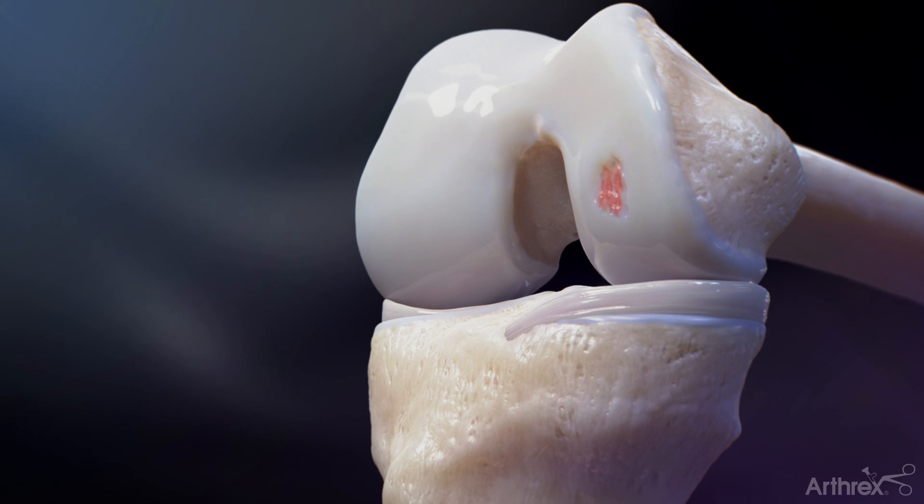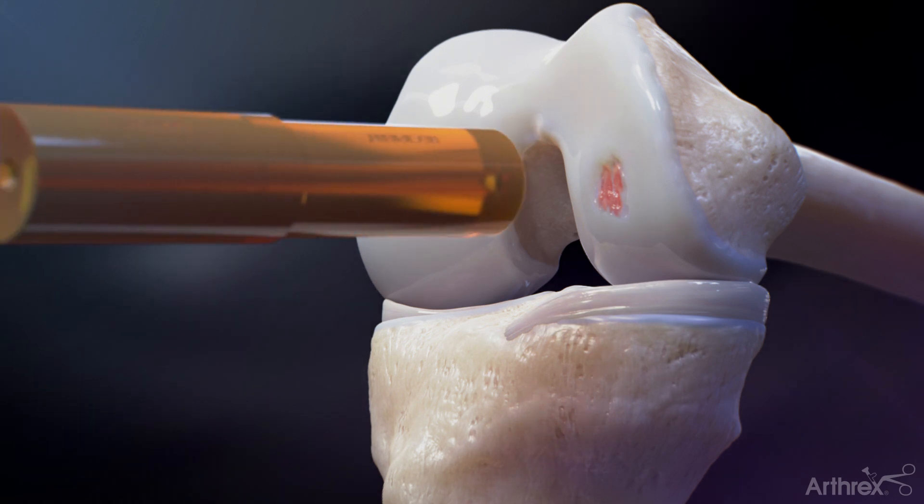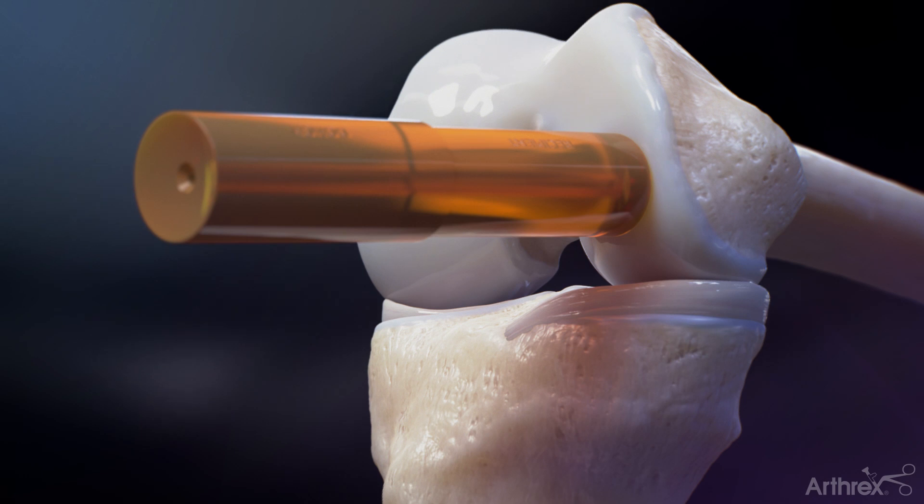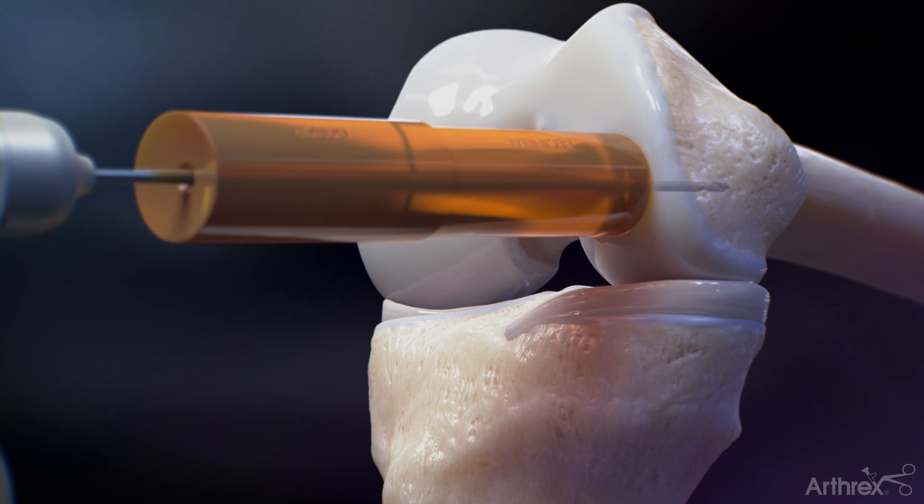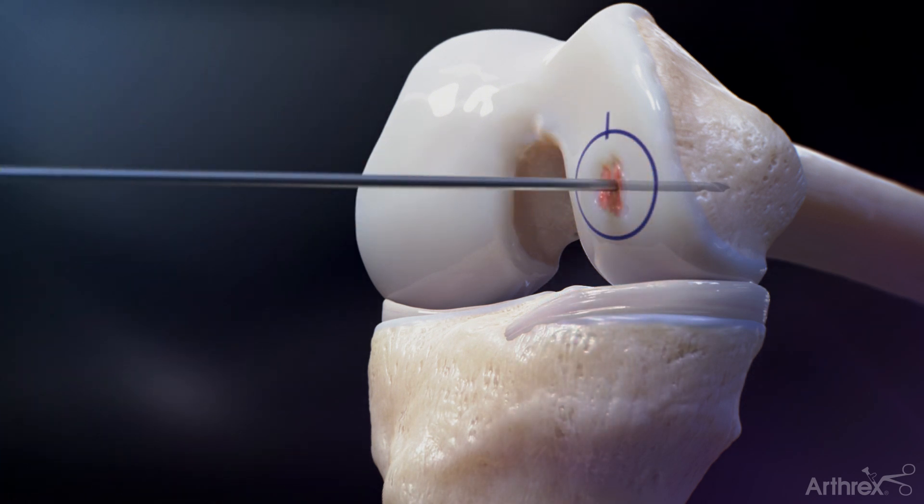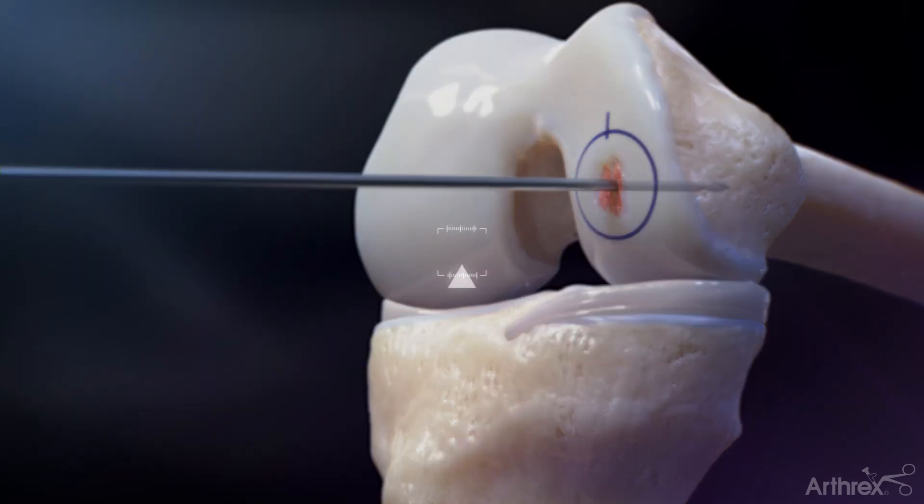Once the appropriate size match has been confirmed, return to the recipient site and place the sizer over the defect, staying perpendicular to the condyle surface. Advance a drill tip guide pin through the sizer into bone. Create a circumferential mark around the cylinder. Remove the sizer and place a reference mark in a superior 12 o'clock position.